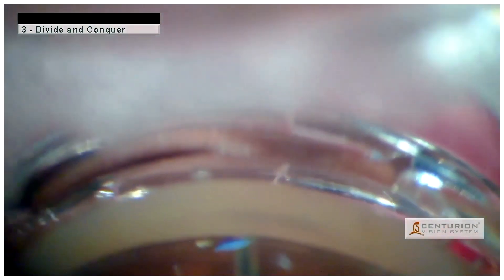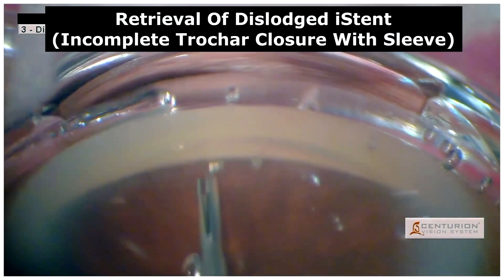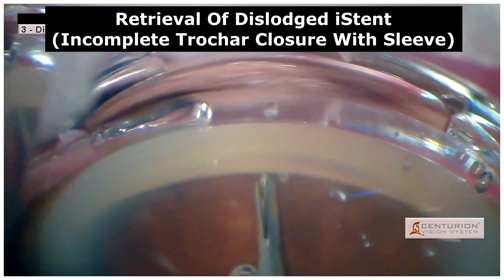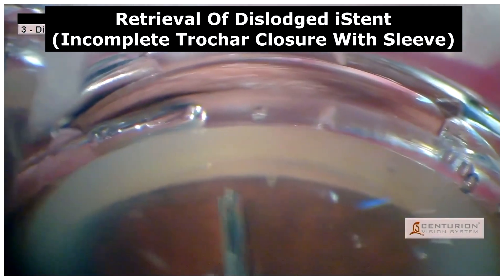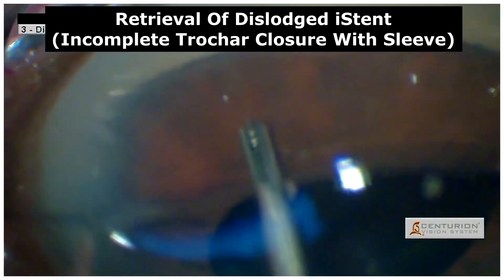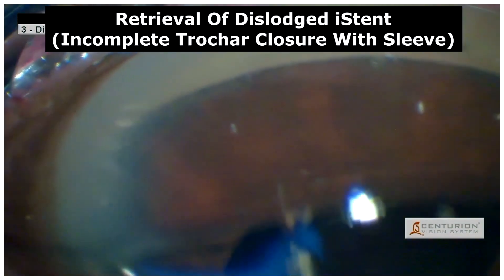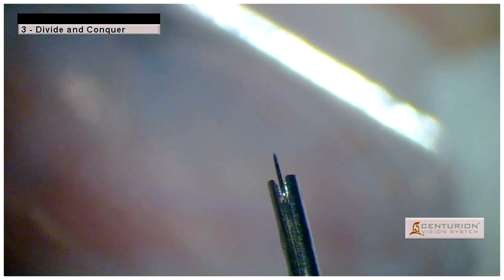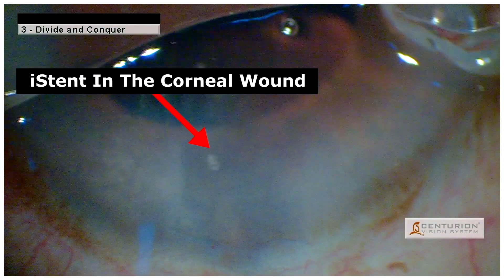Following the implantation, an iStent retrieval was done by re-threading the iStent via the trocar. However, as the sleeve of the trocar was not completely closed when removing it out of the wound, the iStent was lost. As we can see here, it is an empty trocar without the iStent. The iStent was found within the corneal wound.